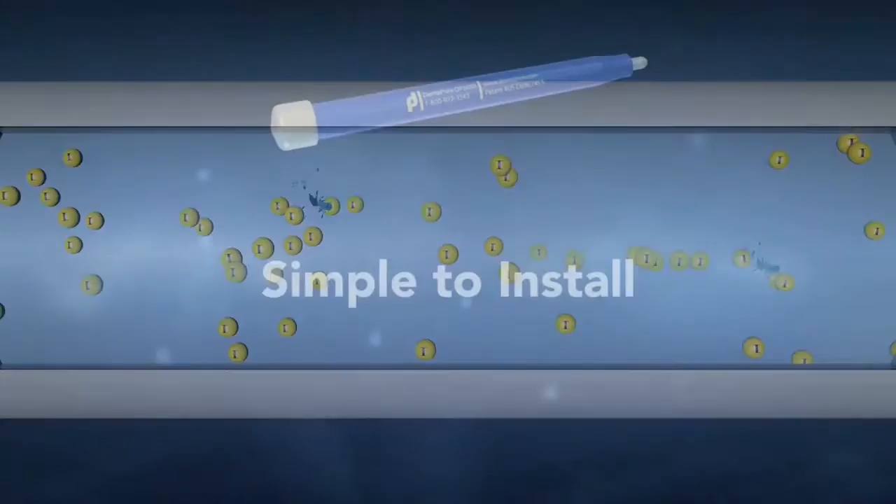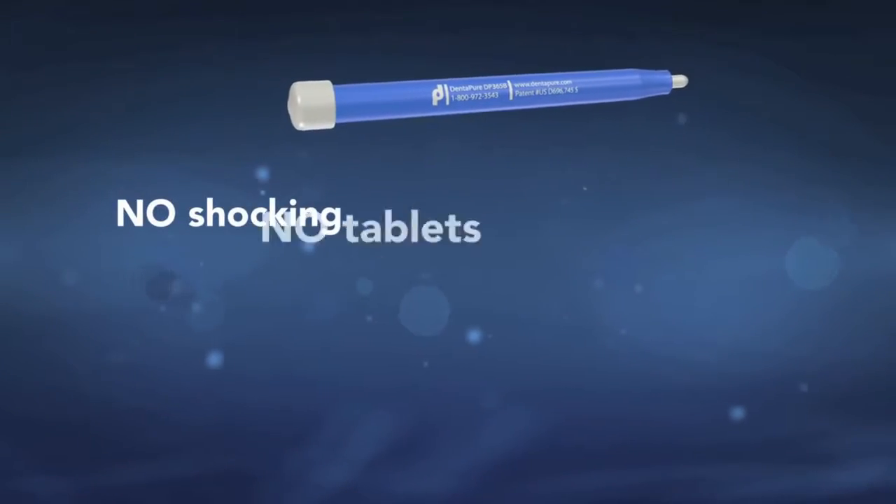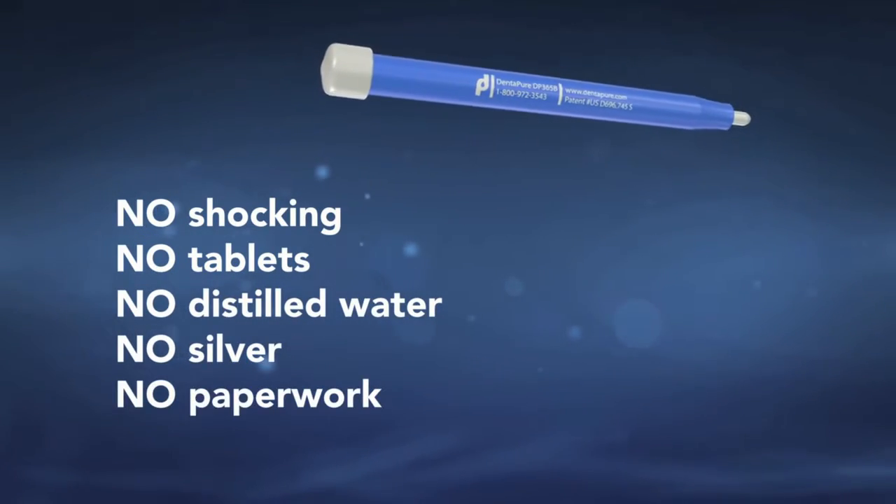Best of all, Dentipure is simple to install. There are no complicated, confusing, or time-consuming protocols.